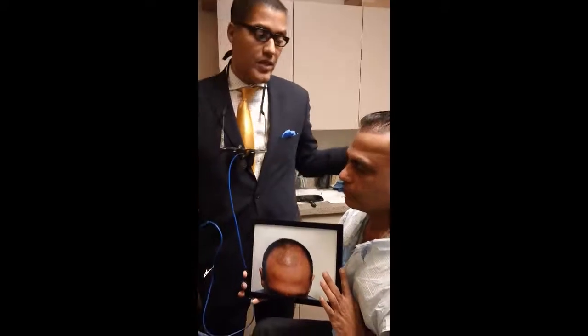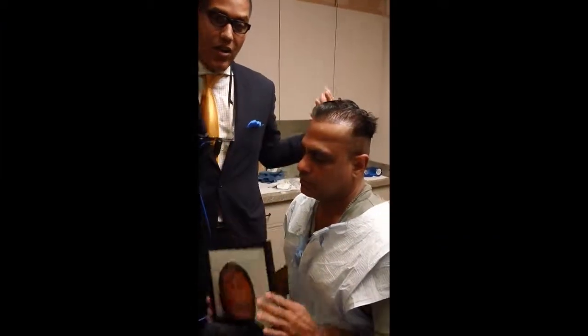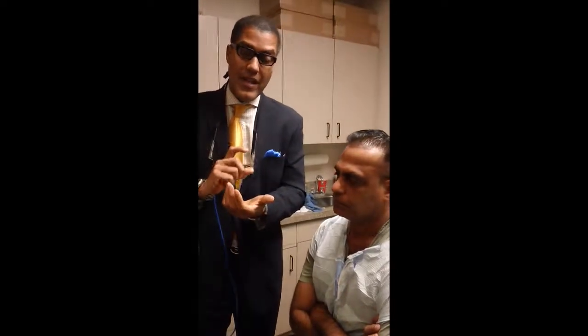So what do you think about today's procedure? Was it just like the rest? You've had all of them now — you've had FUE, you've had the artist. Today I did the FUE myself because it was down at the nape of the neck, which is hard for the artist to do, so I do it myself all the time.